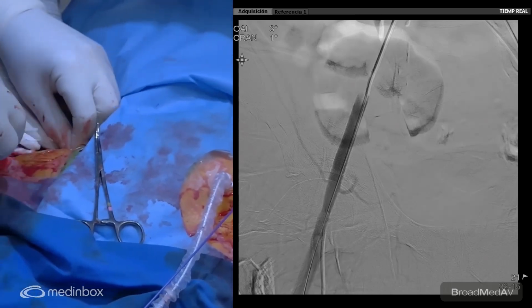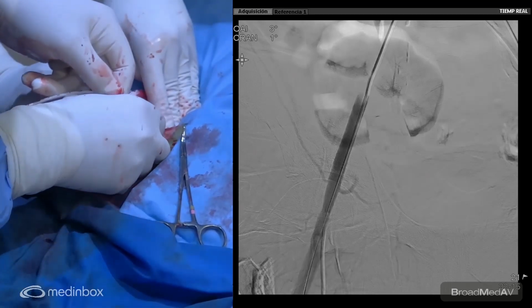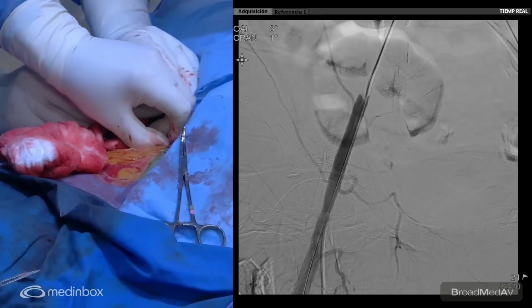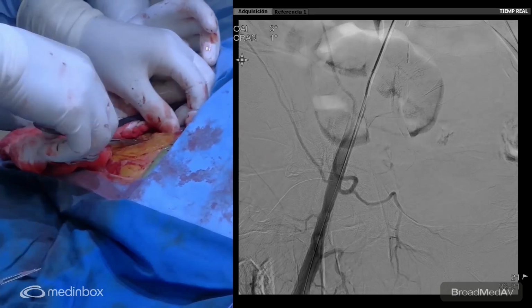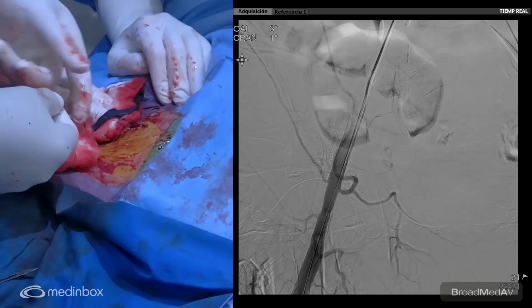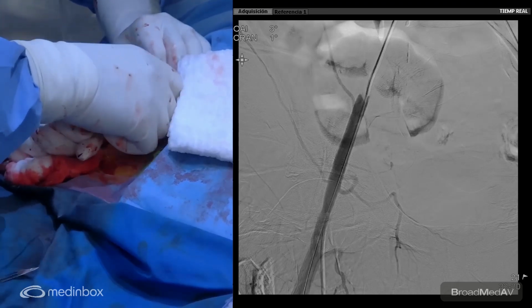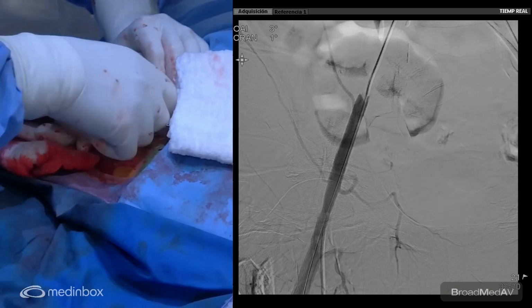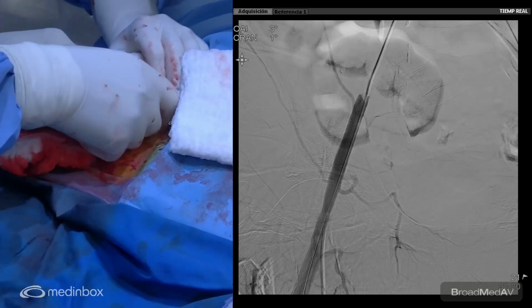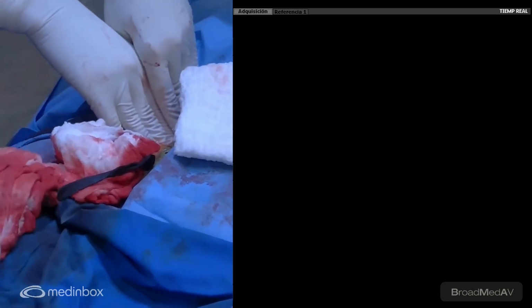You see that the small thing, give me the knife, is exactly below the skin. It's terrible. Oh. It disappears. It's incredible. How big is this patient? So I will tighten all the knots and we'll cut it. Okay. Carlos is gonna hold the balloon. And we can hold the groin.